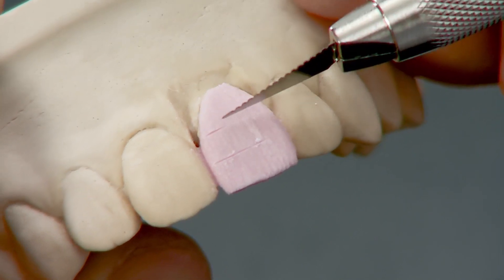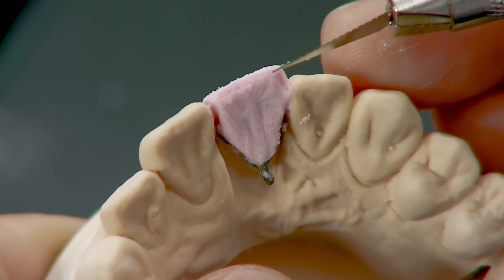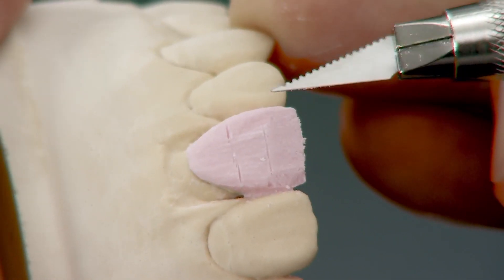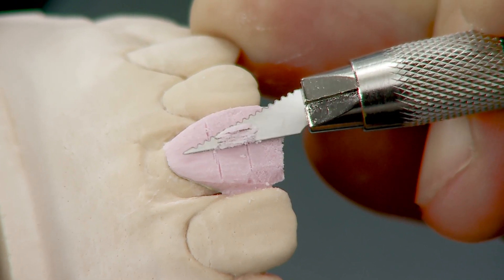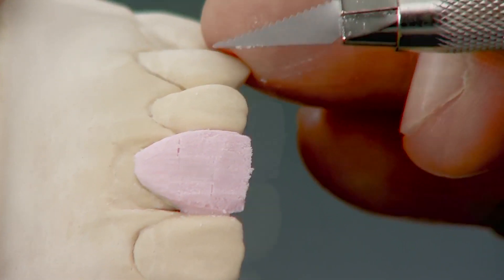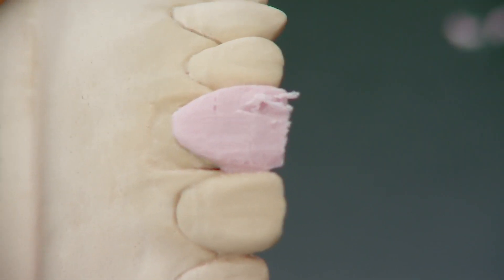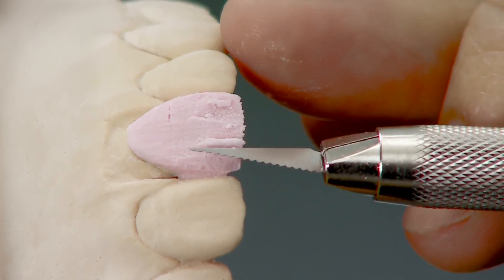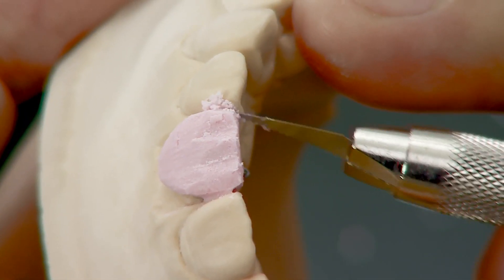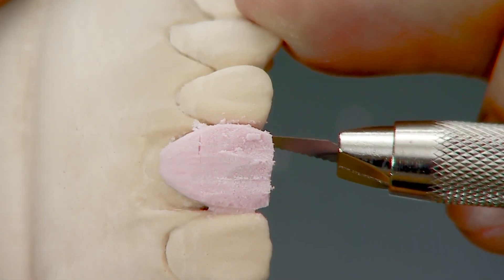Divide the labial surface of the tooth into three parts. First, cut back at the incisal third, followed by a flat cut back at the middle third. Lastly, cut back in between the incisal third and middle third. Reproduce developmental grooves by cutting shallow V-shaped grooves on both the mesial and distal sides at the incisal third. On the proximal surface, cut back by one millimeter on both the mesial and distal sides to create space for the enamel layer.